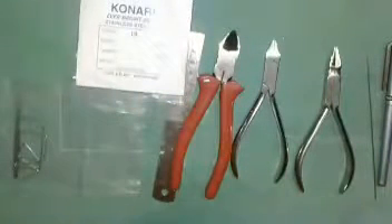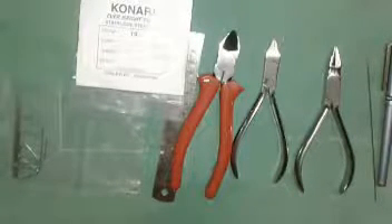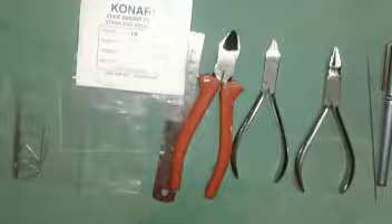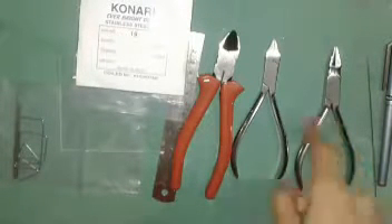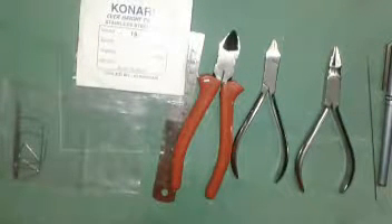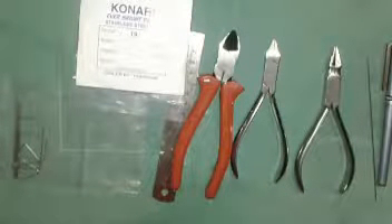Always use the 19 gauge wire for introduction and basic exercises. For beginners, use 19 gauge orthodontic wires only. Orthodontic wires are made up of stainless steel, as you all know. I always recommend Manipal company or GDC company for wires. For the cutter, you can use any company — even a local company is no problem.